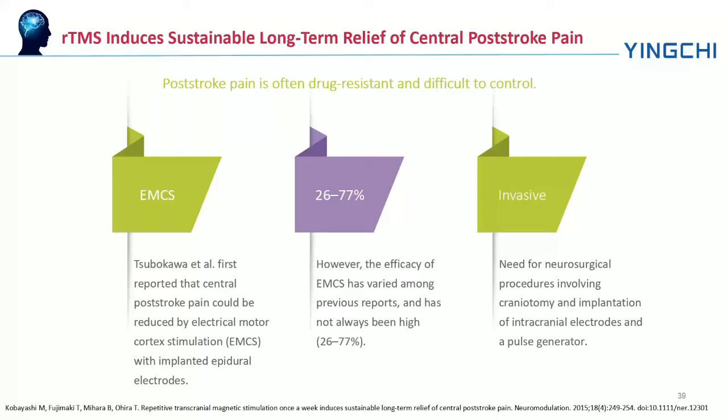But the efficacy of electrical motor cortex stimulation has varied among previous reports and has not always been high. And it needs neurosurgical procedures, which are invasive. So we may need more protocols to improve and relieve the pain of post-stroke patients.